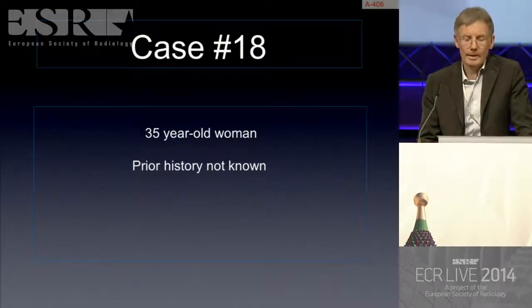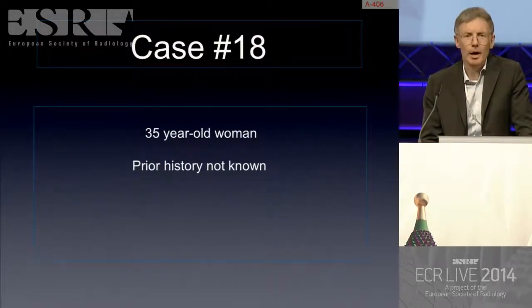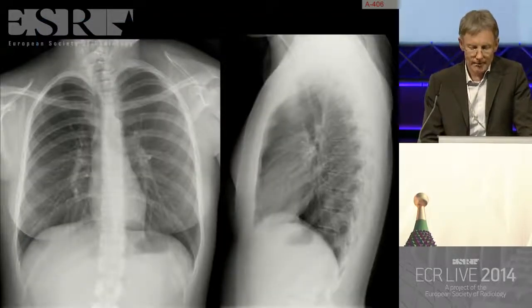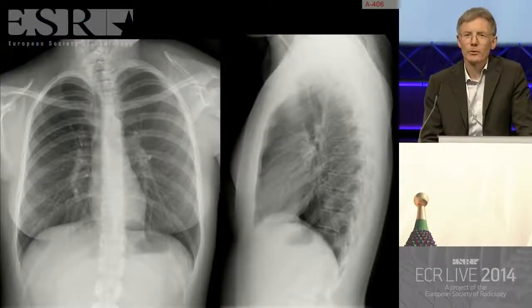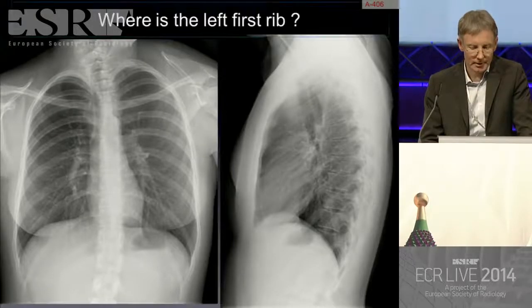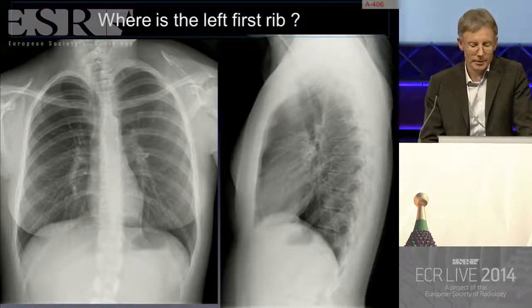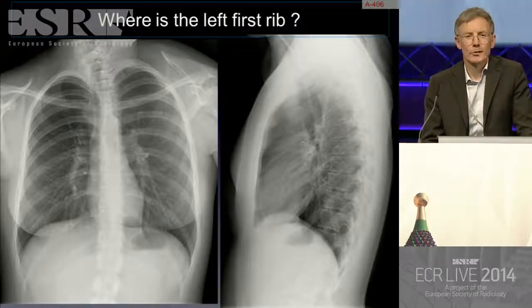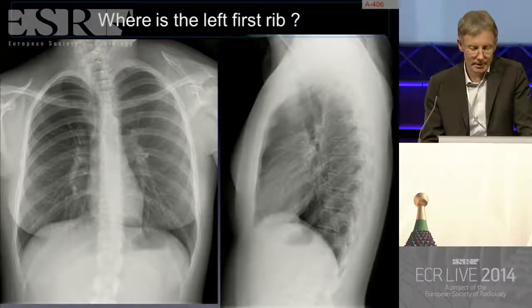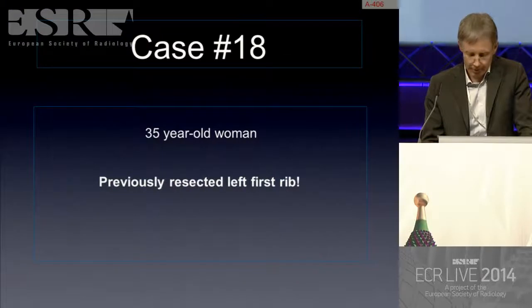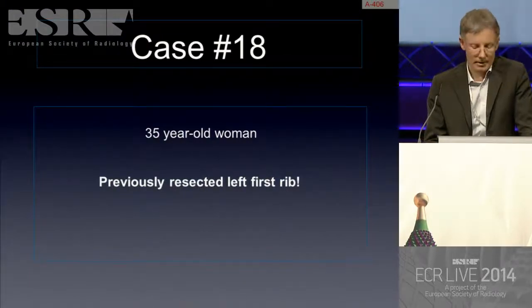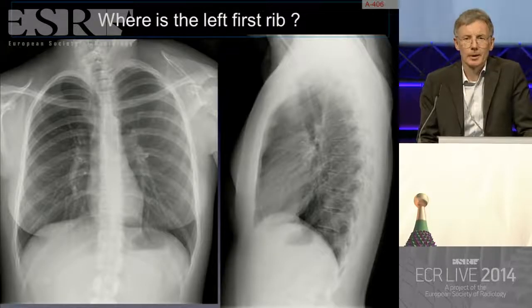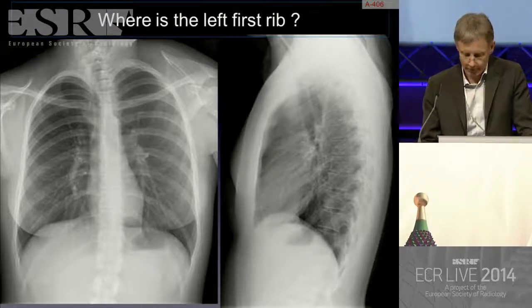A quick case: a 35-year-old woman with unknown prior history. Where is the left first rib? Now that you are concentrating on the apex — this was a previously resected left first rib. Remember to look at the apices and compare density in that region.